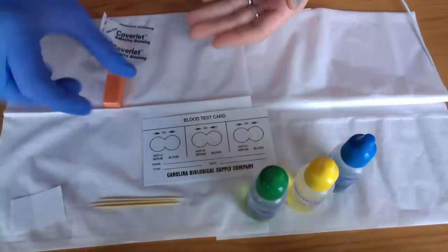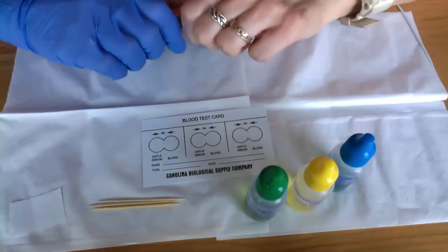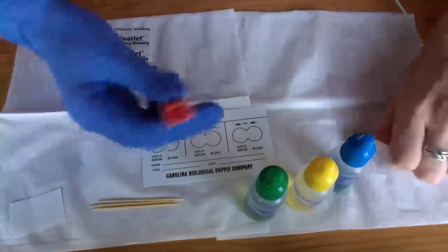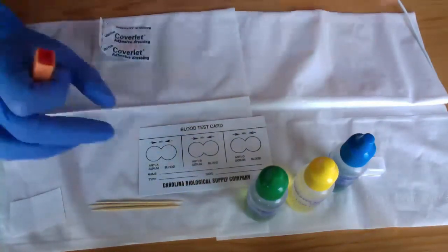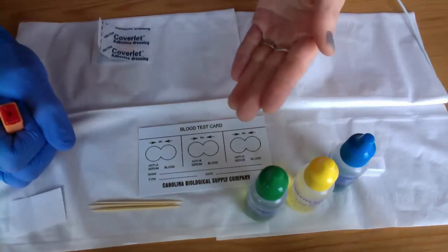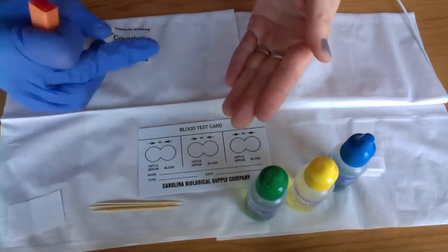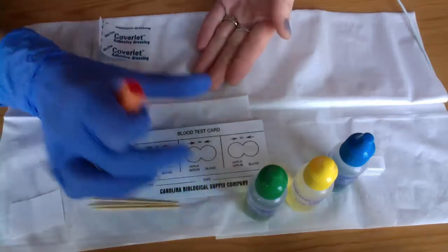And then here's the tricky part. This is where you have to stick your finger with a lancet. So you're going to pull off the top here. Here's my lancet. The trick to this is you have to hold your hand down, because intuitively your hand is going to want to move away. I always tell my students that your hand kind of has a mind of its own, and you don't know that until you try to prick it.